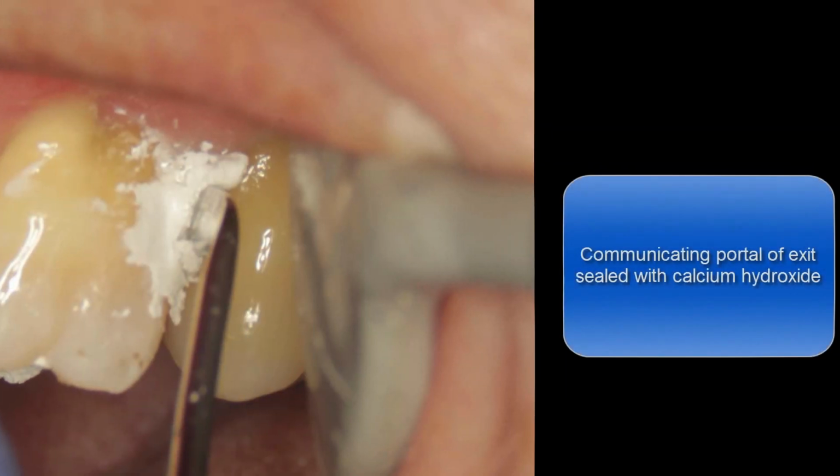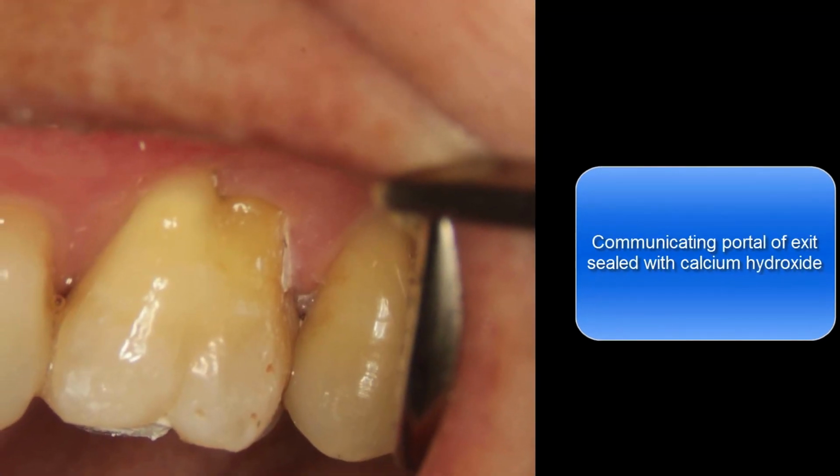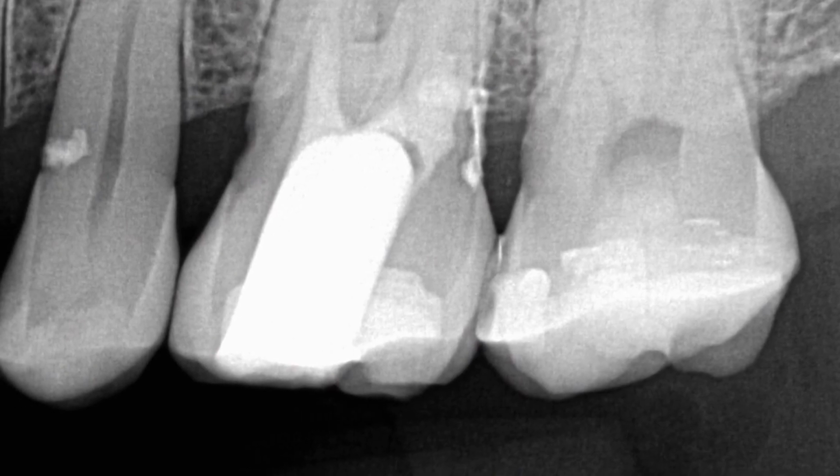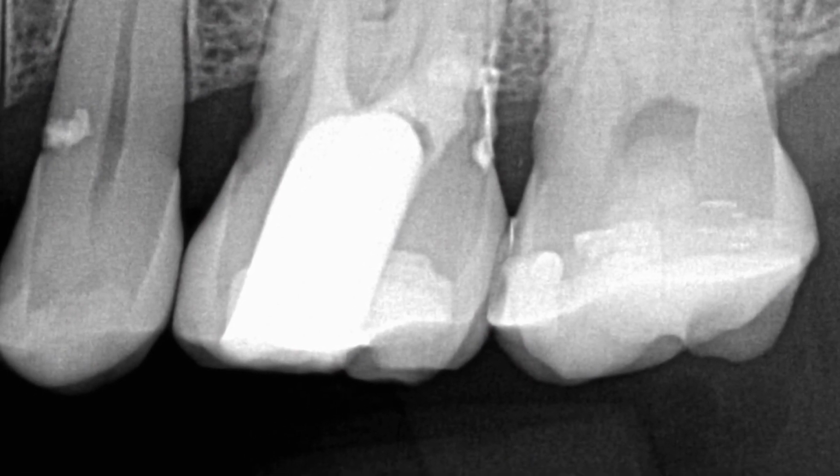The excess was cleared away and then Cavit placed to seal the area externally. It's more favorable if the resorption defect does not communicate through the sulcus. In the video of the second visit, which was 1 month later, we'll show you how we dealt with it.